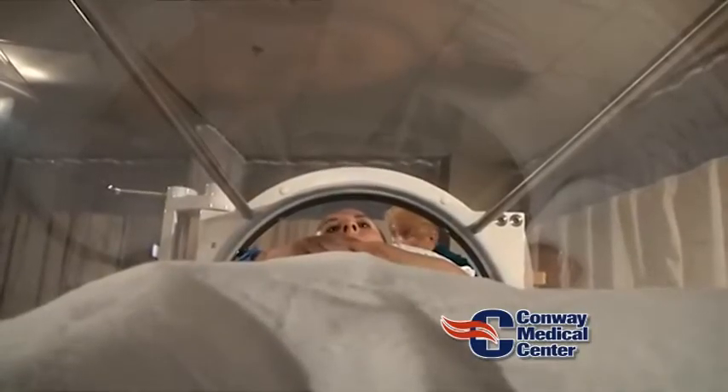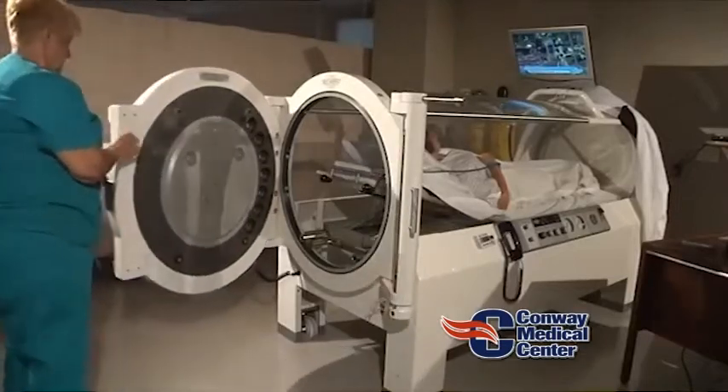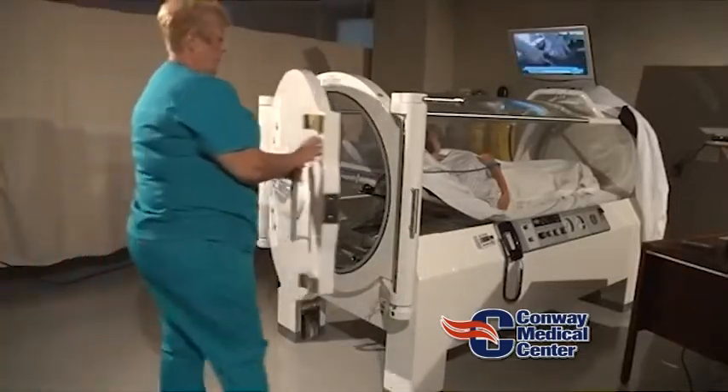When you first go into the chamber, it can be kind of apprehensive, and so a lot of patients will say, well, I don't know if I'm claustrophobic. I'm worried about being in that space for so long. But we find that after patients have gone through one or two sessions, they feel really comfortable and relaxed and almost look forward to going into the chamber.